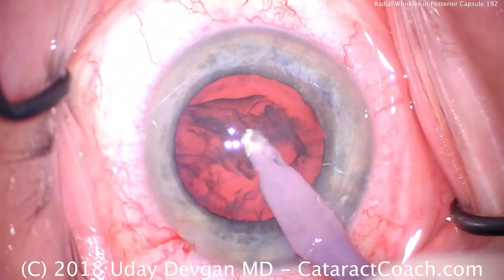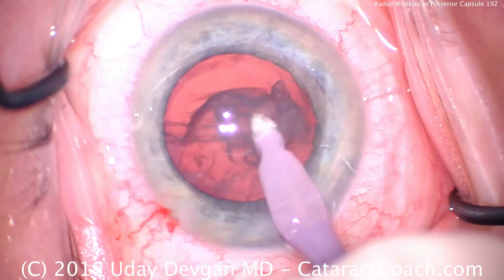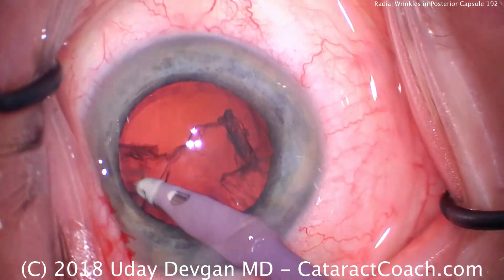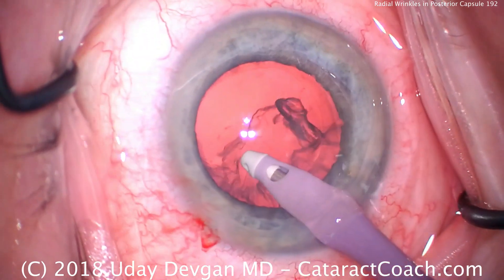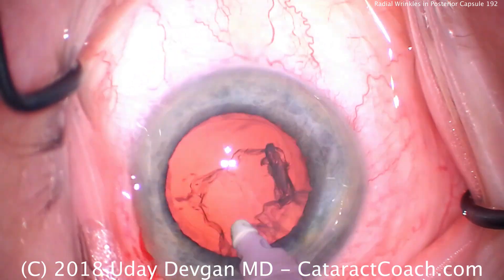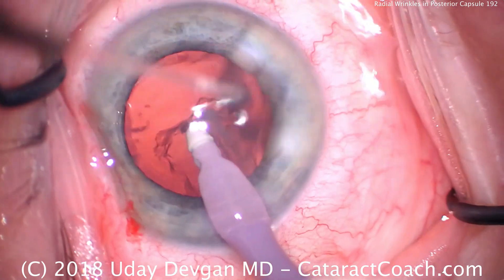Circumferential removal here of the cortex. Now in the sub-incisional area, watch carefully as I remove the cortex just inside the incision — I'll inadvertently grab the posterior capsule, and you'll see the radial wrinkles. I'll show you what I mean; it's coming up very shortly.